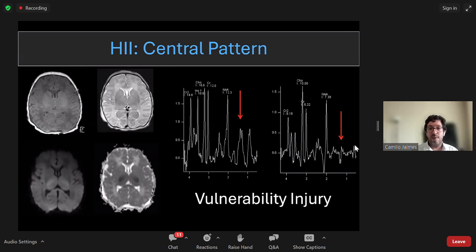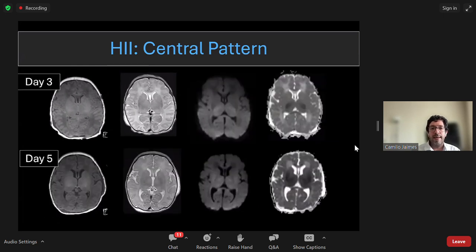The reason to keep the short echo time is that it's obviously a richer spectrum with regards to substances and small molecules that may have shorter T2 values, and for those reasons decay faster. So if you don't know whether you may be dealing with some inborn error of metabolism, it is actually helpful to have the full spectrum so that you can work with both. But if you knew you were in the space of hypoxic ischemia for certain, then I think it could be reasonable to just get the intermediate or the long echo time.